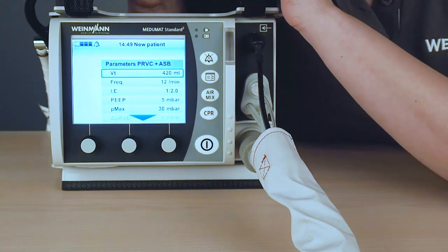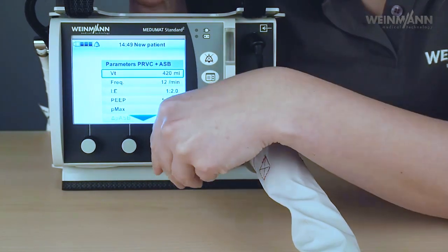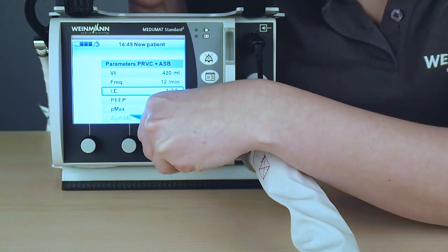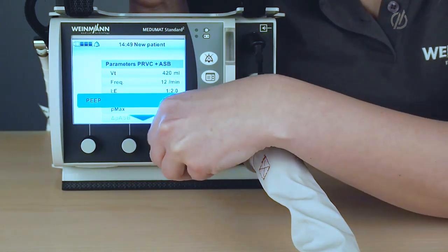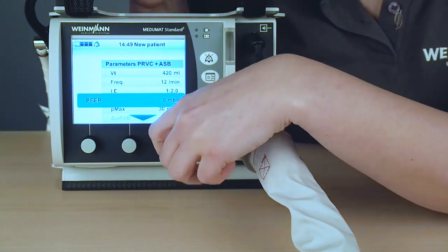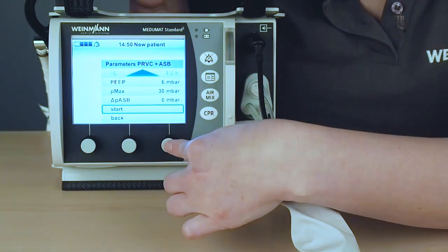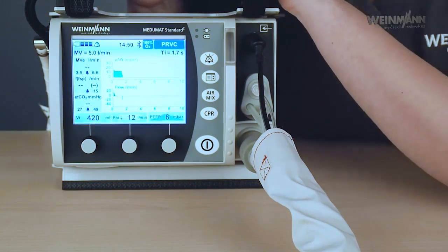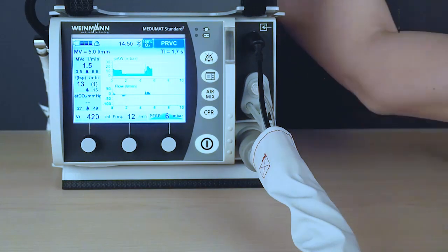420 in this case, this equals 6 milliliters per kilogram body weight. Also, the frequency is calculated by the height and the inspiratory to expiratory ratio. But I also have the possibility to change the settings here. Now I would like to start my ventilation by pressing the knob. And now the device starts with the PRVC ventilation.